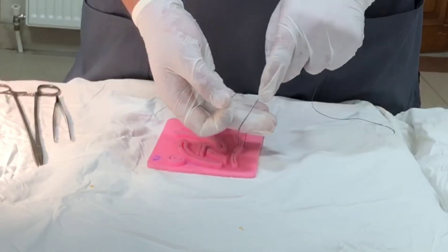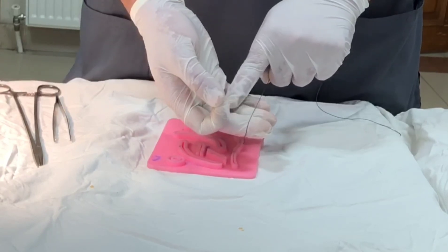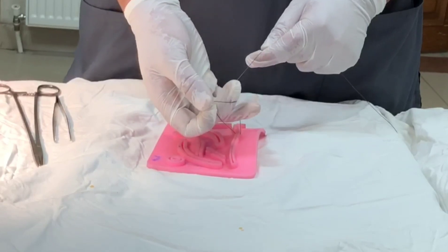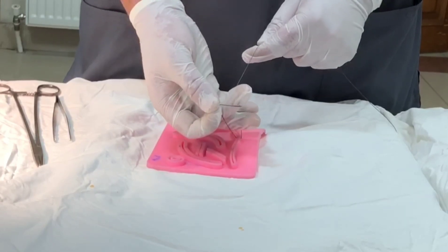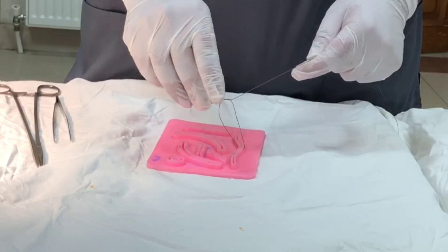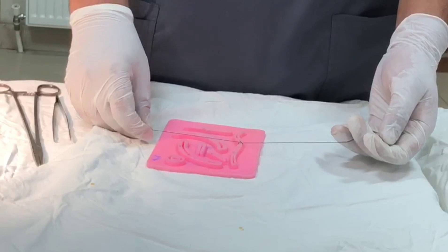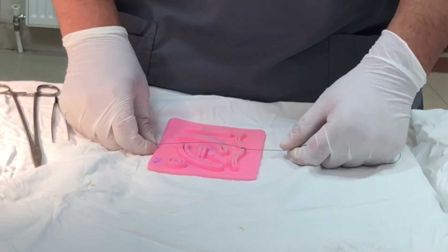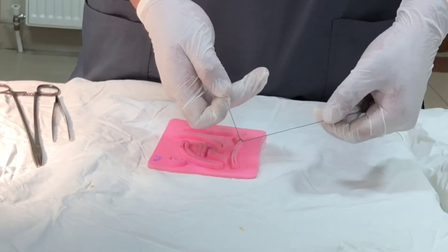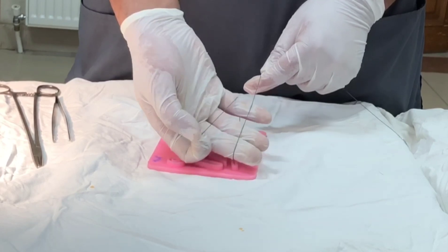These two threads should be parallel to each other. I'm going to fish it out with the middle finger and hold with the ring finger, come out, and tie in the same direction. This is the one-handed reef knot first throw. For the second throw, wrap around and come over — similarly parallel to each other.